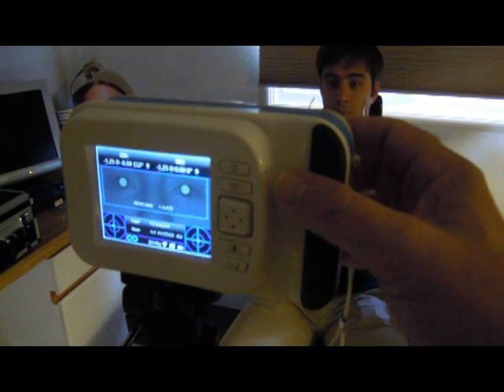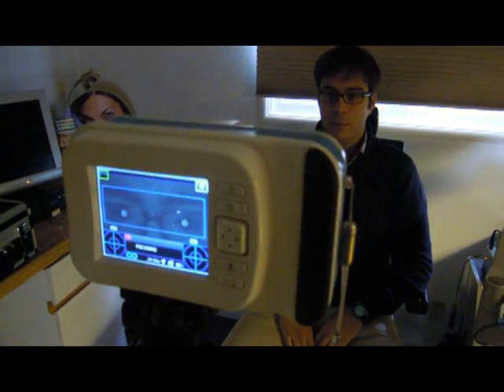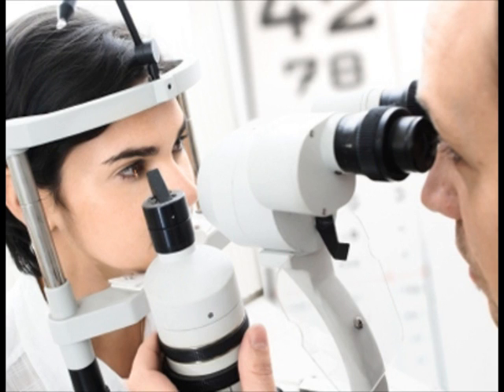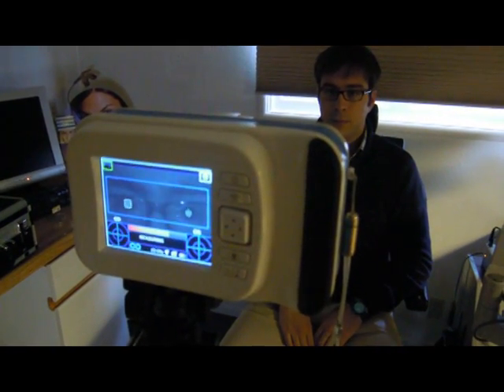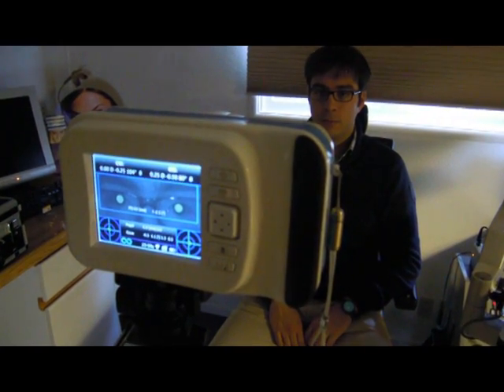The 2-WIN also allows you to over-refract patients that are wearing contact lenses or glasses. This is a great way to convert shoppers to patients in the office while they look for glasses, or are waiting for their friend who may be getting an eye exam. Over-refraction of contact lenses or glasses is as easy and accurate as without correction and is done the same way.